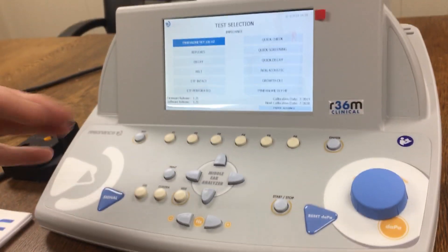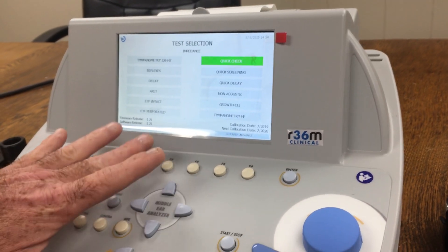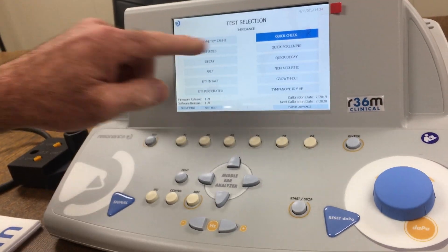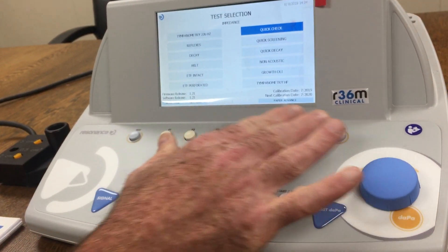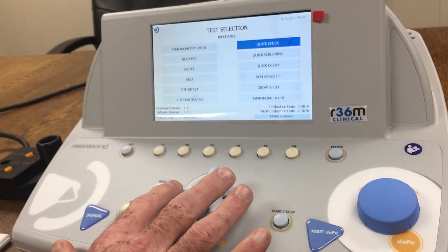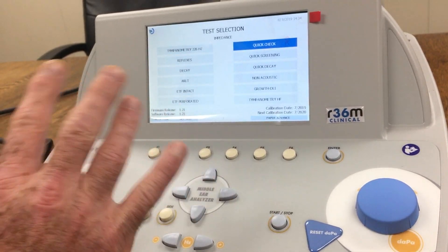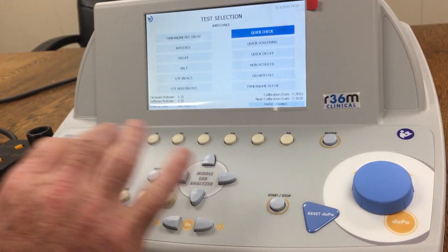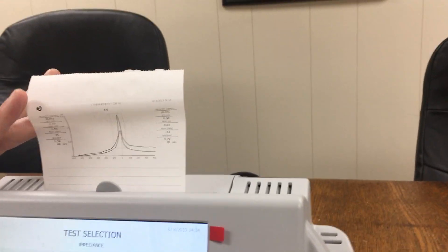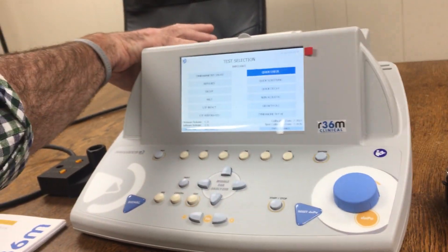Depending on what test you want to start with, you can highlight the test, click set test, then click F2 to confirm. When you turn it off and back on, it'll be highlighted and ready to go — all you have to do is hit enter. Using the left and right arrows on the four-way keypad, you can navigate where you need to go. Personally, I use quick checks because I can do a tympanometry and a reflex all at one time. There's also a paper advance button since you get a roll of thermal paper for printouts.